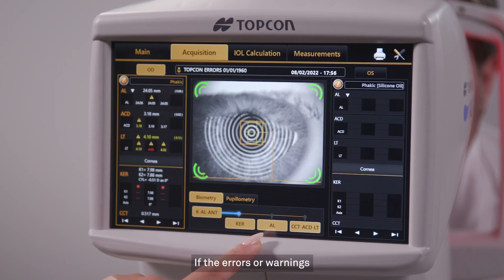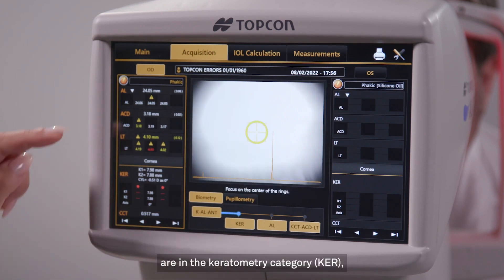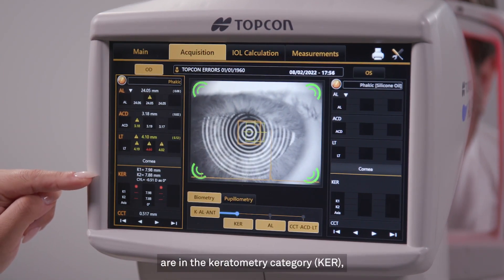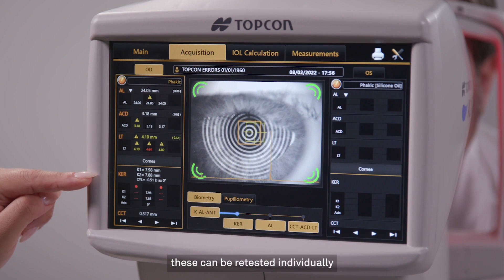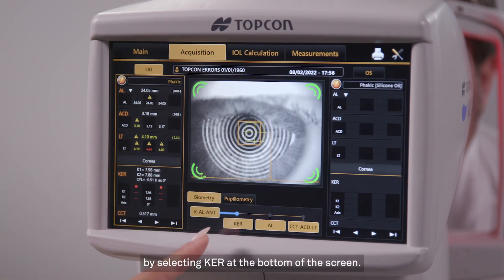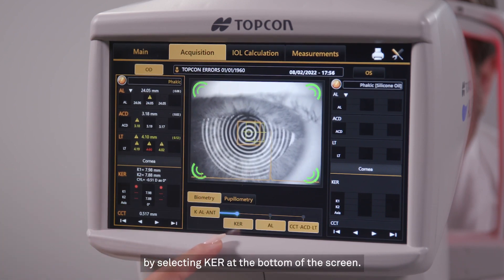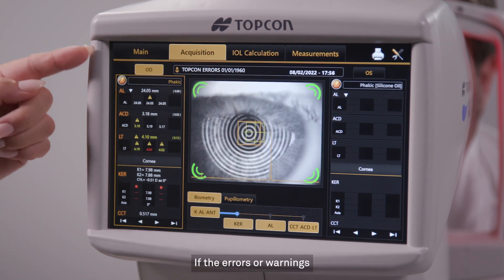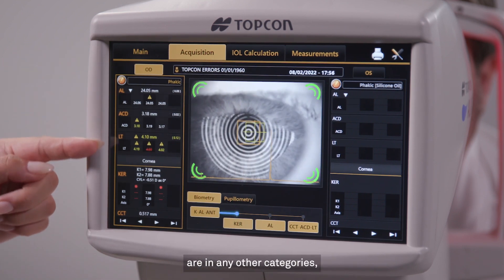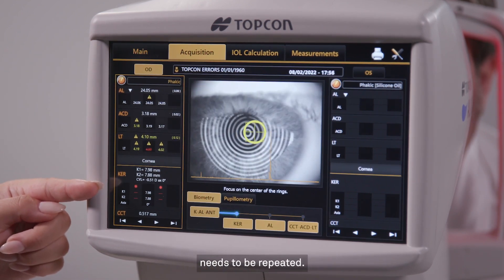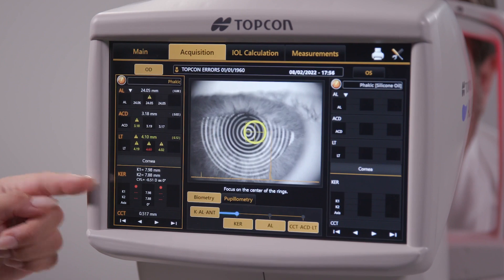If the errors or warnings are in the keratometry category, KER, these can be retested individually by selecting KER at the bottom of the screen. If the errors or warnings are in any other categories, the entire sequence of testing needs to be repeated.